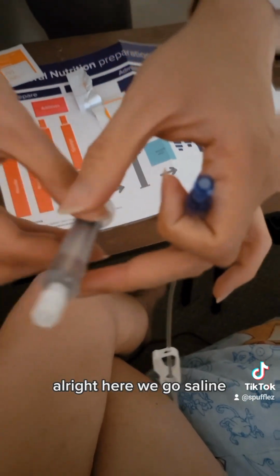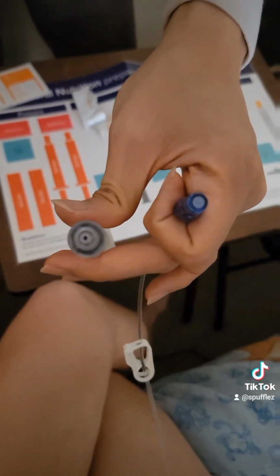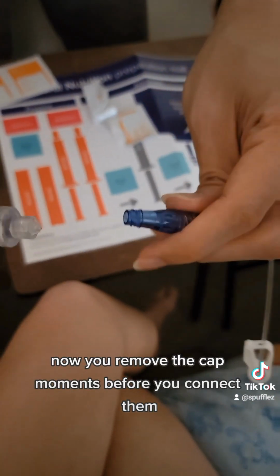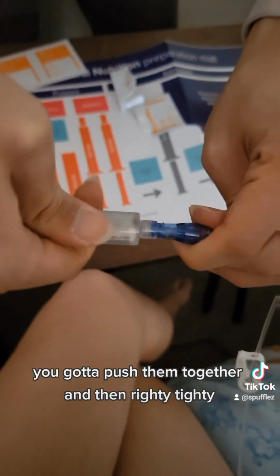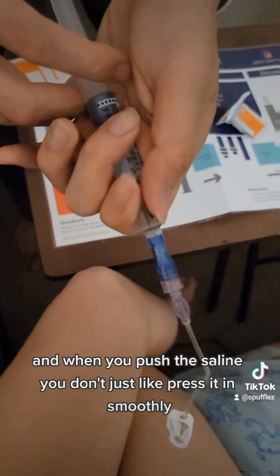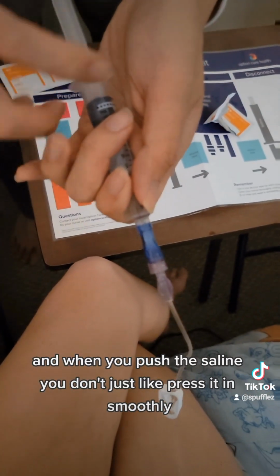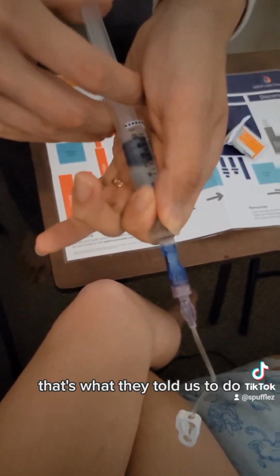All right, here we go. Saline, remember you gotta get the air out the top first, which we've already done earlier. Now you remove the cap moments before you connect them. So you gotta feel a little pressure. You gotta push them together and then righty tighty. And when you push the saline, you don't just press it in smoothly. You gotta do sort of a jabbing motion. That's what they told us to do.